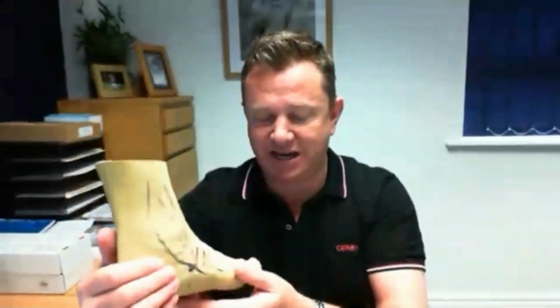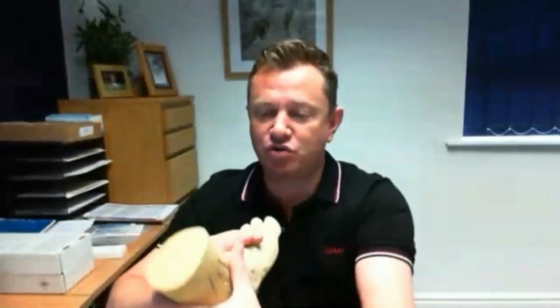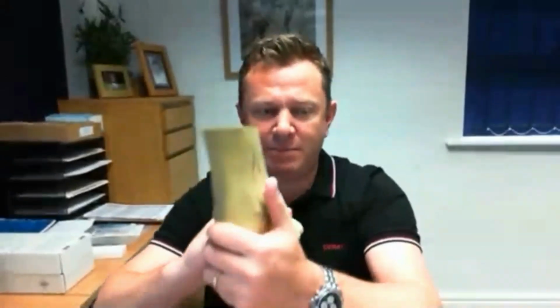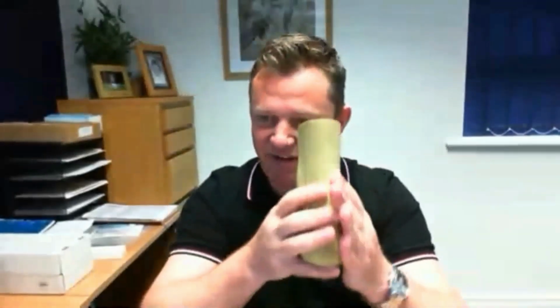And we need to be thinking about the kinetic application of this rather than the position of the heel. When I teach people to cast AFOs now, I tell them to let go of the heel. I want them to control the foot in the position that they want it to be, and the heel will find its happy place. I then do put features in to hold that, and I do have things that close around it all the time, but I am not aggressively trying to force the heel into a position it doesn't want to get to, unless that patient has a massive hindfoot structural instability. So huge amounts of ligament laxity, perhaps injury to the spring ligament, and that's where I might do it differently.